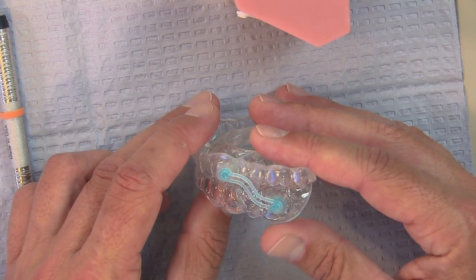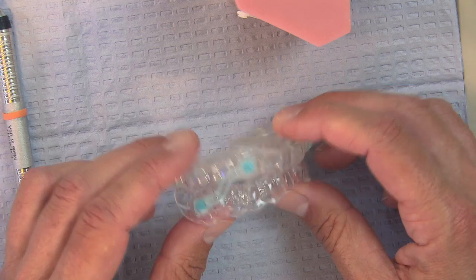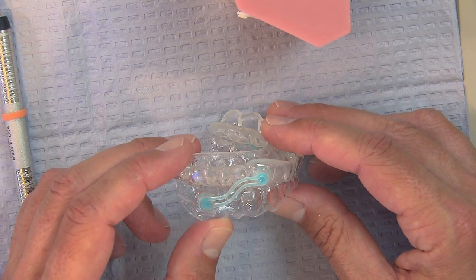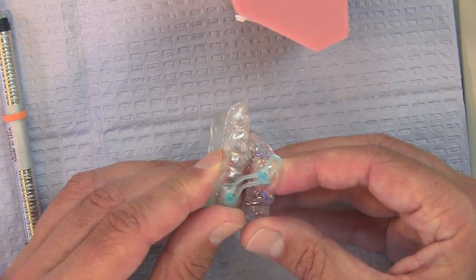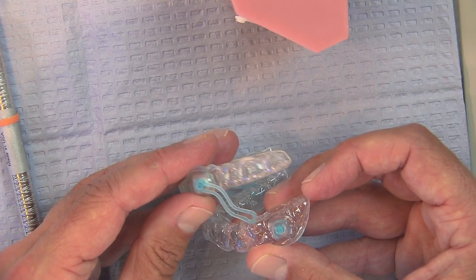But maybe the biggest deal to us as dentists is the fact that the patient can now change these themselves, because the old system required a Bart Parker knife and some special pliers. It always had to be done in the dental office, but now these are easily done by the patient themselves at home. You can see how simply this comes off.